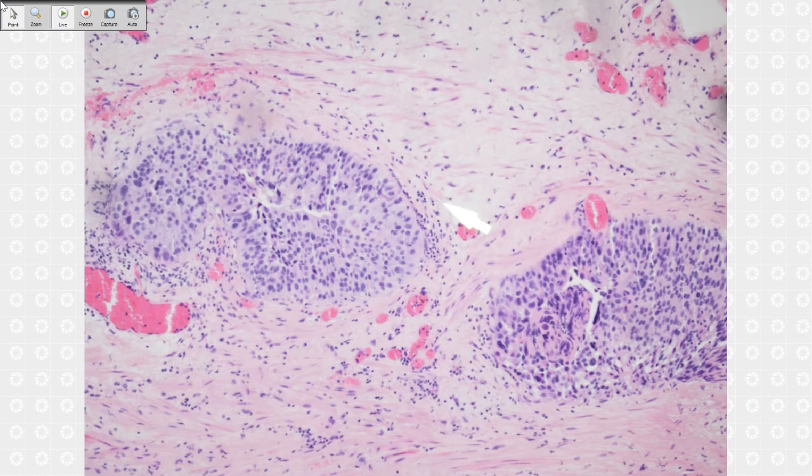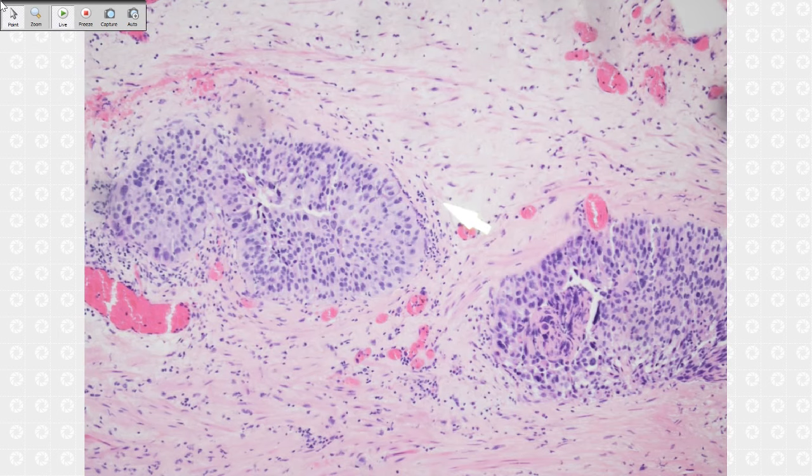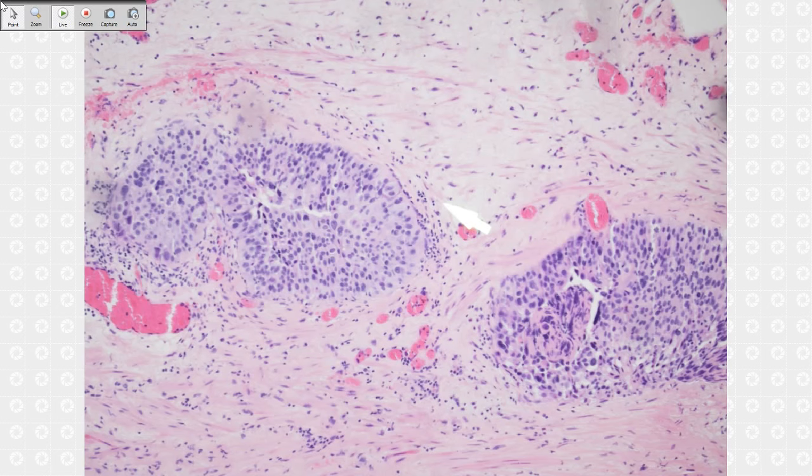This guy has an invasive urothelial carcinoma, and a cystoprostatectomy was done. You see the small focus here. Remember, is this stroma invasion or not? You have to remember, if T4, that means prostate stromal invasion. Dr. Haynes gave a very detailed explanation: through the bladder wall, into the soft tissue, and all through the prostate duct spreading to the stroma.